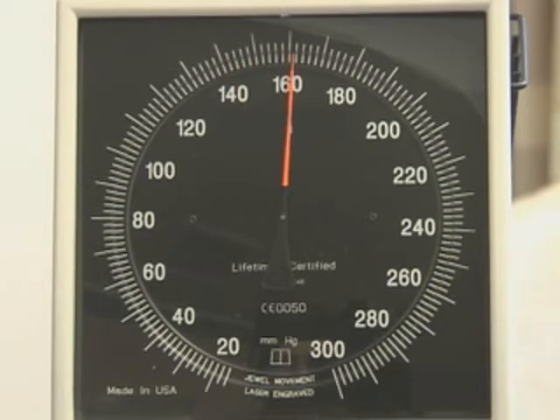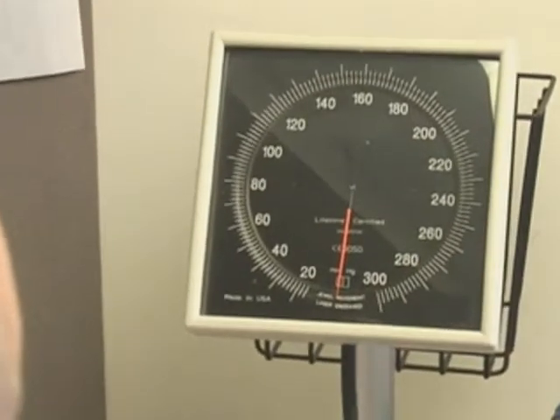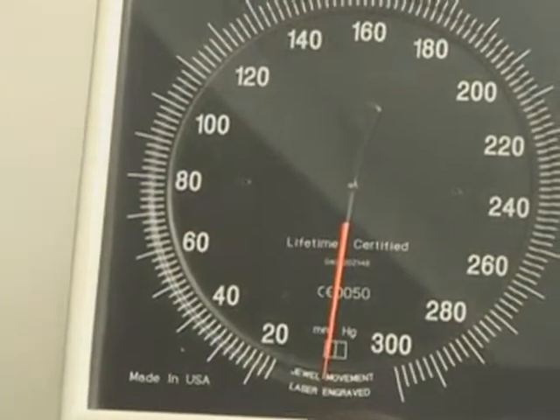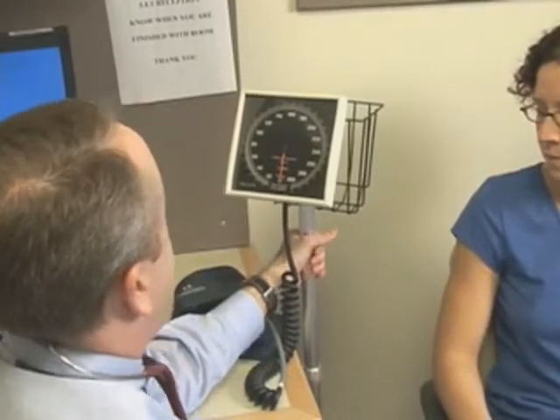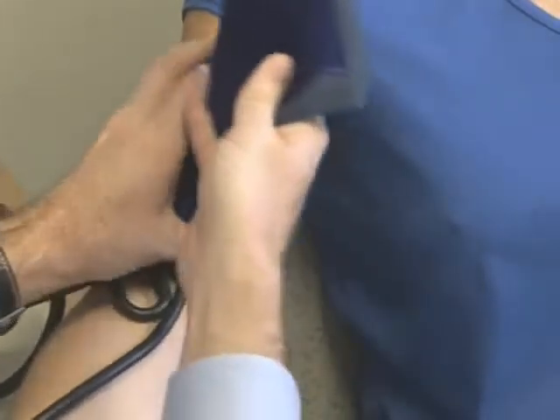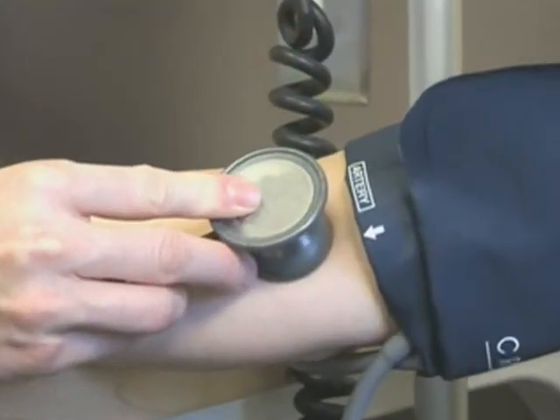Certain conditions may complicate blood pressure measurement or interpretation. In such settings, decreasing the rate of deflation and averaging several readings may improve accuracy. Observer bias is usually the most common error that occurs in blood pressure measurements. It occurs because practitioners often show digit preference and/or rounding of the terminal digit. When two people use the same correct technique for measuring blood pressure, there should be little inter-observer variation.